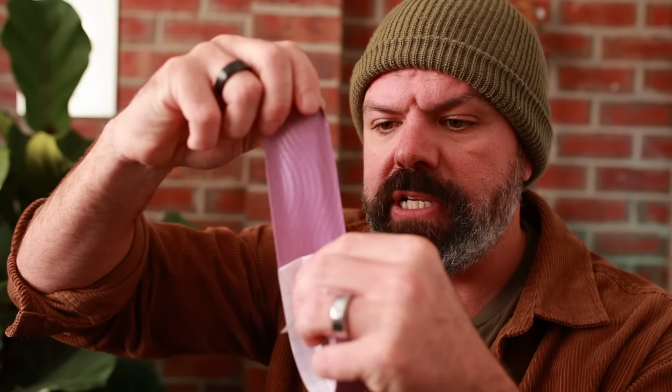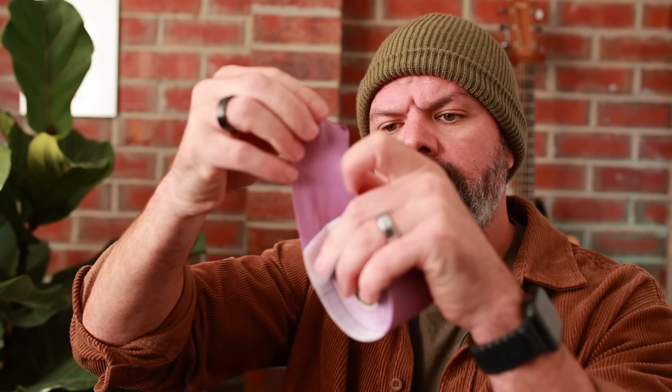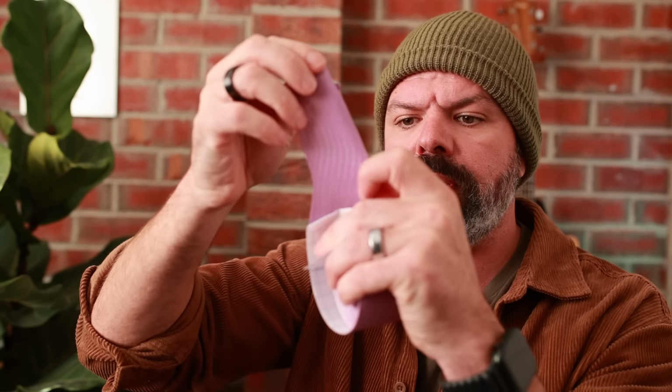Or you can buy pre-cut mouth strips as well, but let me show you that there. So see how it's this stretchy tape and it's breathable. You might not be able to see it here, but it's fabric. It's not super easy to breathe through. You could cut a hole if you like, but that's something you can check out.